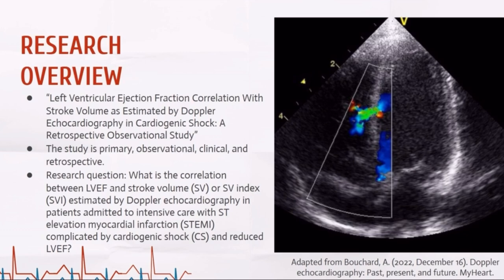So they investigated the correlation between left ventricular ejection fraction and stroke volume or stroke volume index estimated by Doppler echocardiography in patients admitted to intensive care with ST elevation myocardial infarction complicated by cardiogenic shock, and reduced left ventricular ejection fraction.